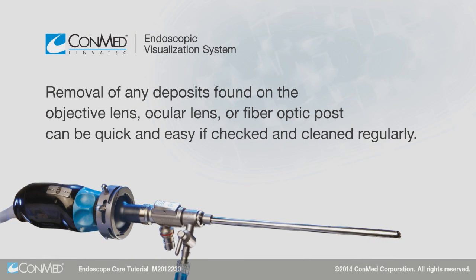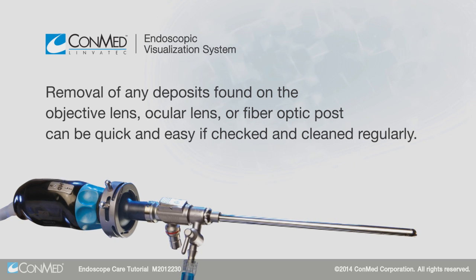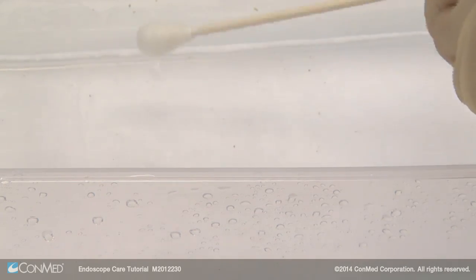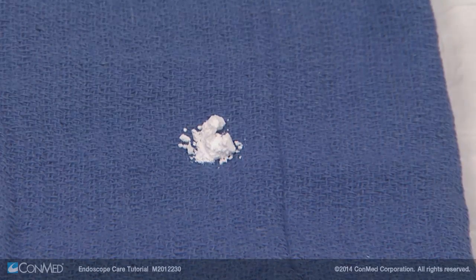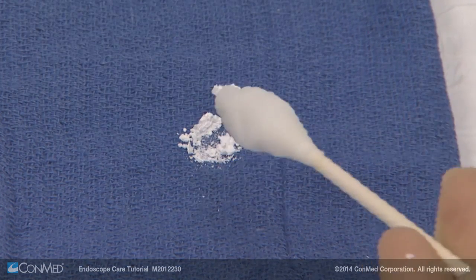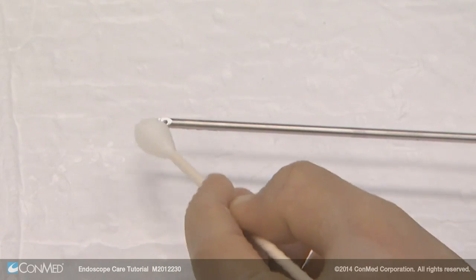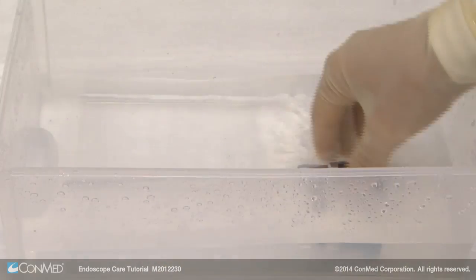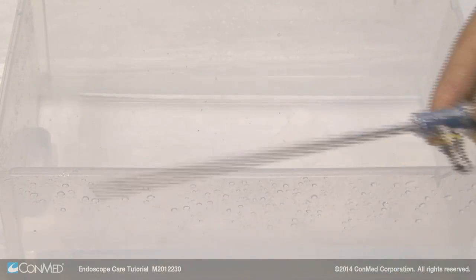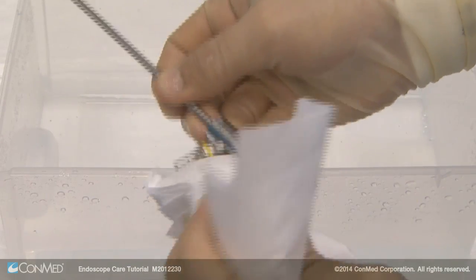Removal of any deposits found on the objective lens, ocular lens, or fiber optic post can be quick and easy if checked and cleaned regularly. To clean, first moisten a cotton tip swab with water. Dip the moistened swab in aluminum oxide powder, which is included with any ConMed Linvotec endoscope purchase. Next, gently press the swab onto the optical surface and scrub the window in a circular motion. Rinse the optical surfaces with distilled water to remove any remaining powder. If stains are still present, carefully clean with a cotton swab and isopropyl alcohol.